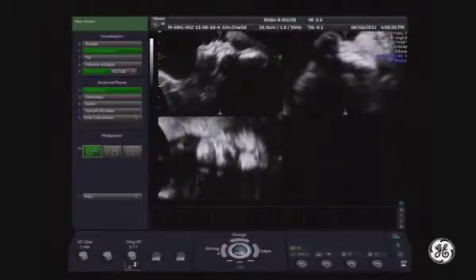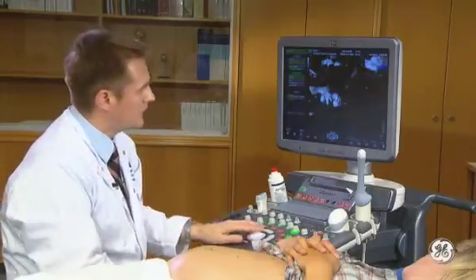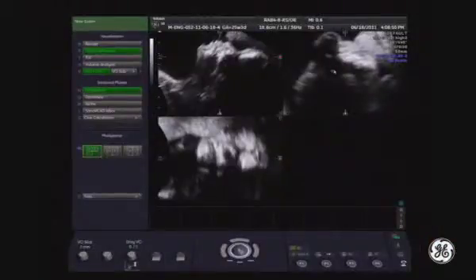And here you can see that this part was hidden because diagnostic view is this transverse view here. But this part was hidden behind a shadow, and we can see just this little part of the palate. This is the anterior lip, and the other part of the palate is not seen here. So we need to repeat this acquisition.